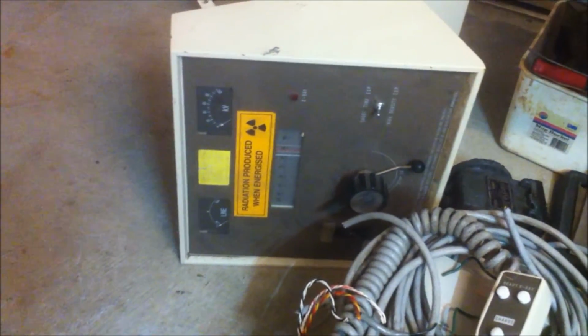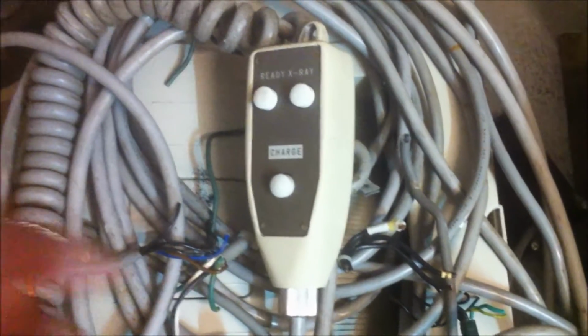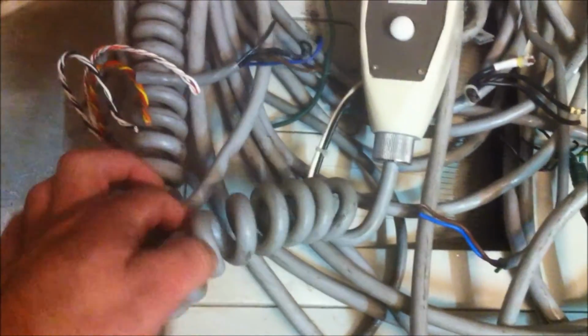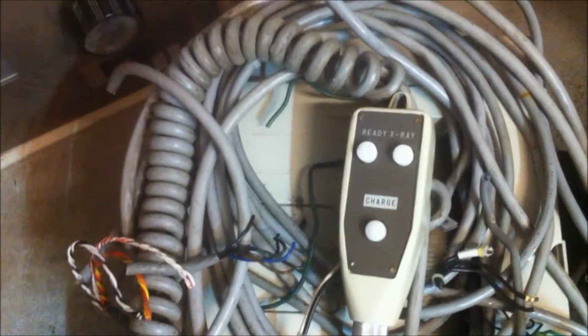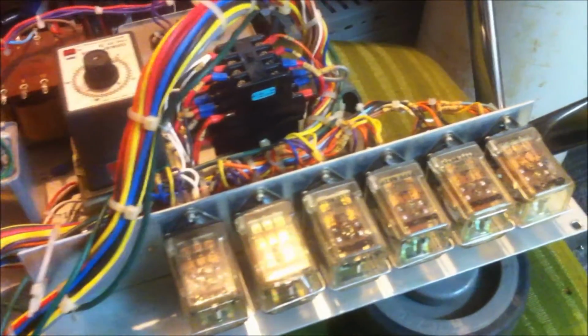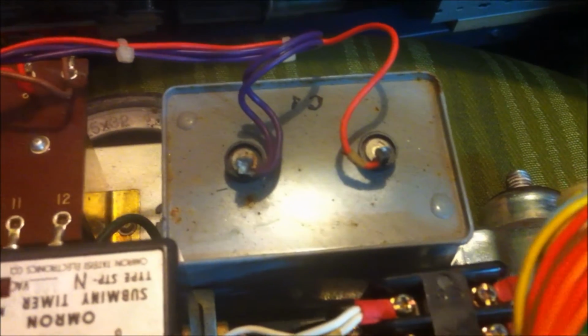As you saw in the previous video, I kept the whole control panel in one piece. Everything's still attached to the back. I also kept this little push button remote controller unit here. It's on this thick corded cable, so I might use that on my black box, might not. Here's one of the boards that I kept from the X-ray machine. All the relays there. Getting close, you can see the contactor, AC capacitor, little transformer, a timer, little DC capacitor there, and a massive wiring loom.